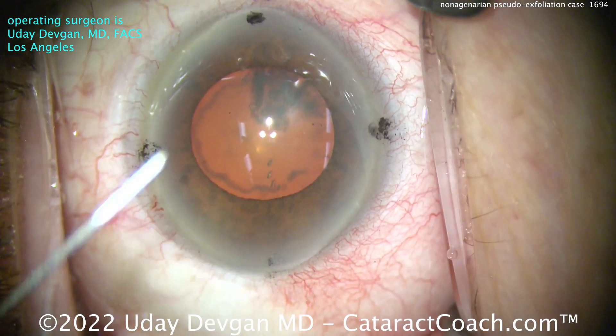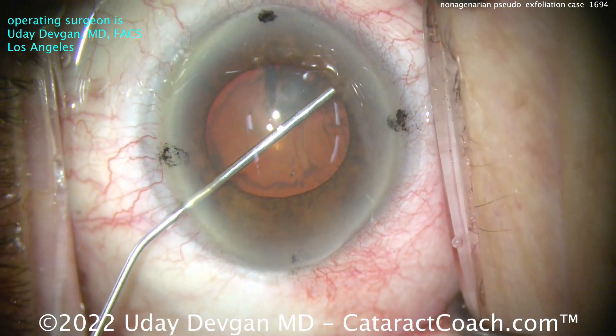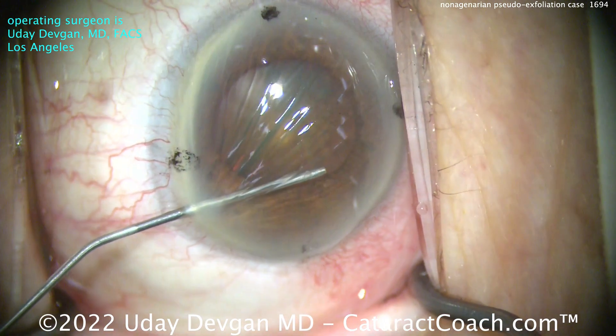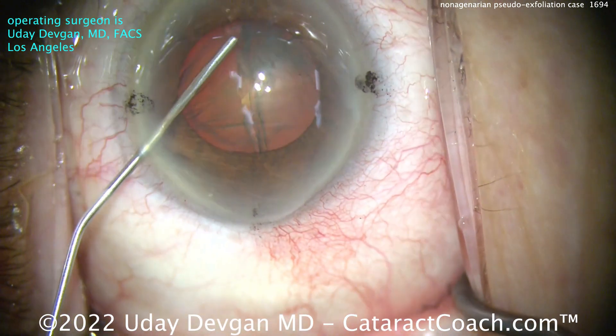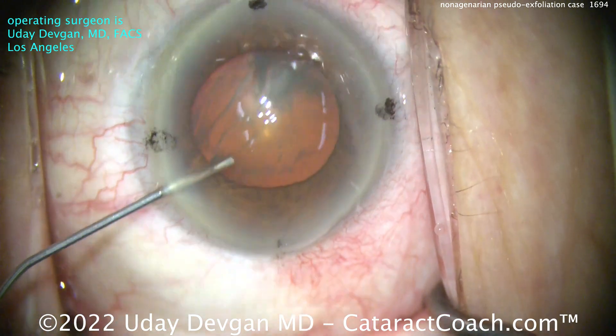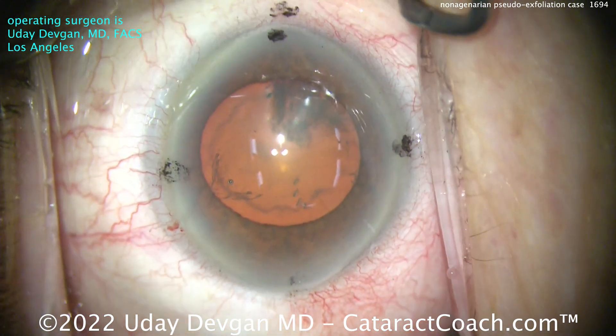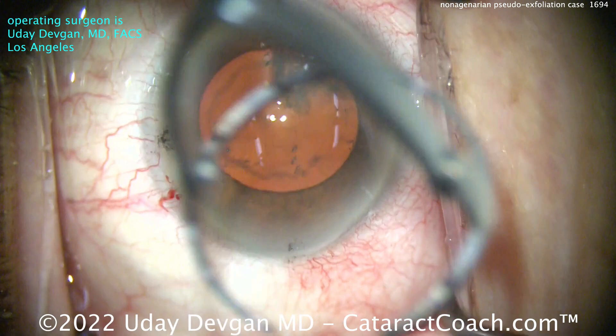This is a patient who's more than 90 years old, and look at that pseudoexfoliation material. We'll put in some viscoelastic here and try to do what's called viscomydriasis. Bobby Osher taught me this. Injecting the viscoelastic — a dispersive agent here at the pupil margin — and you can get a temporary expansion of the pupil, probably an extra millimeter or so. Look at that. Definitely works.